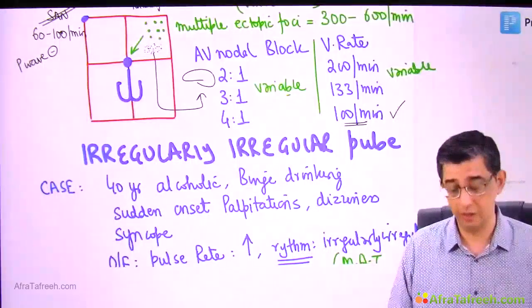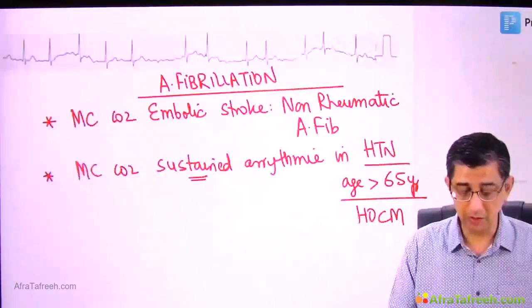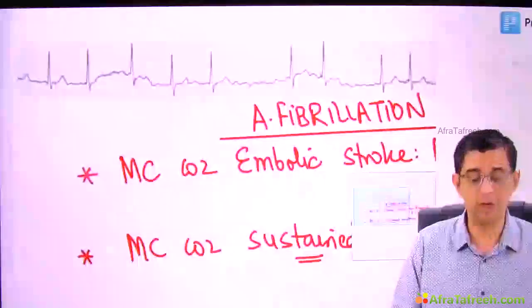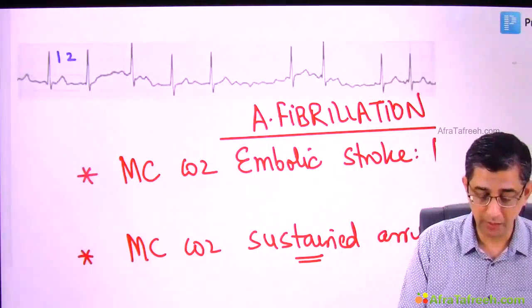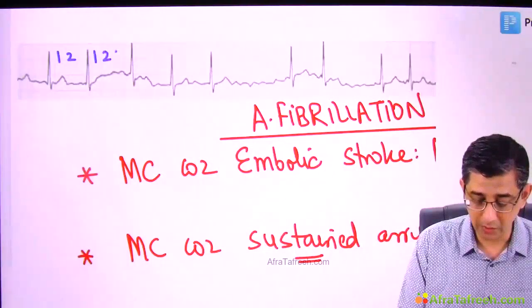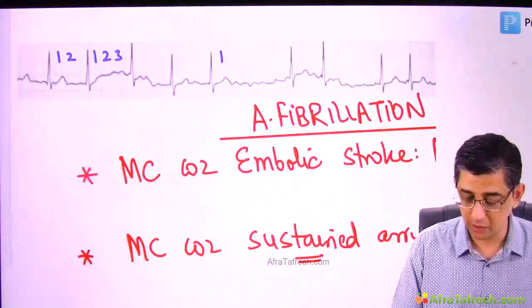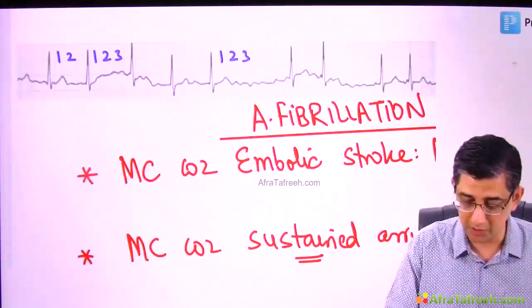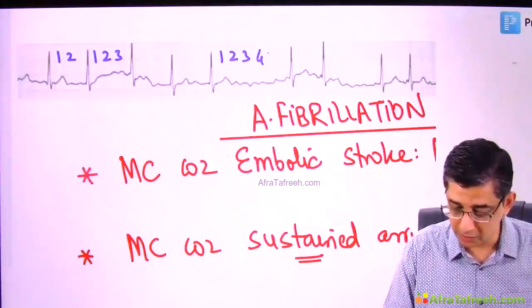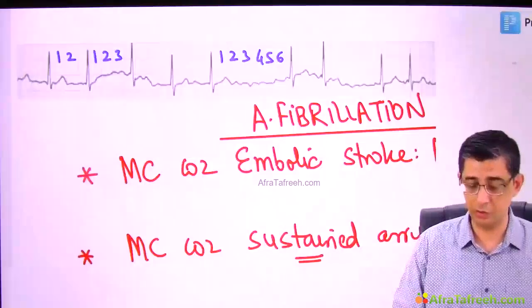No big deal about it. So I'll just focus on the ECG that I showed you earlier, and I want you to notice that if you look at the number of large squares present between the R and the R waves, I'm just highlighting those large squares which can be easily deciphered by you, because lots of times I understand the resolution issues can be there.